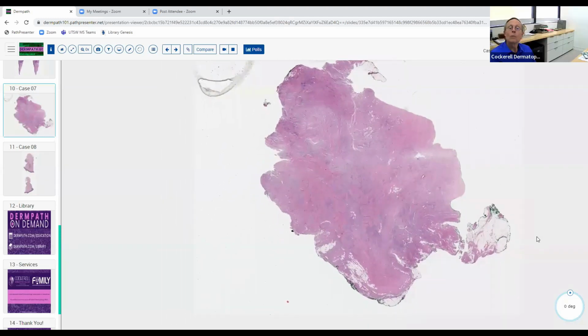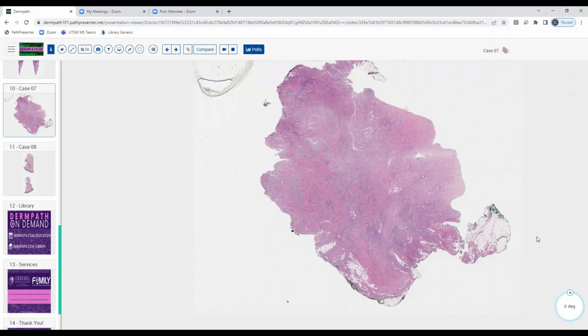This is an interesting one, a little more challenging here. So probably this one is less likely to be on the exam, but it's still worth going through it and coming up with a differential diagnosis here. Hi, my name is Jessica. I can do this one.